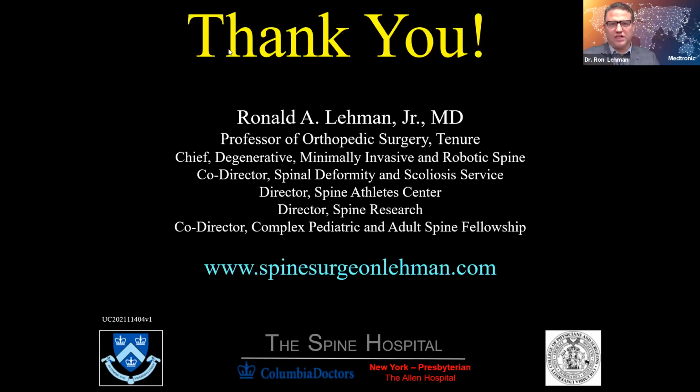Yeah, I think it's a great point too, that one of the things I found by placing the implants first, which I do now with robotic assistance, as opposed to where I used to do it, is that when you have the screw or the screw shank in the pedicle, it basically lights your way to go down. And so it tells you exactly where the interbody space is going to be, whether it's a primary case or revision case. And you go just cephalad to that, right there on top of the pedicle.